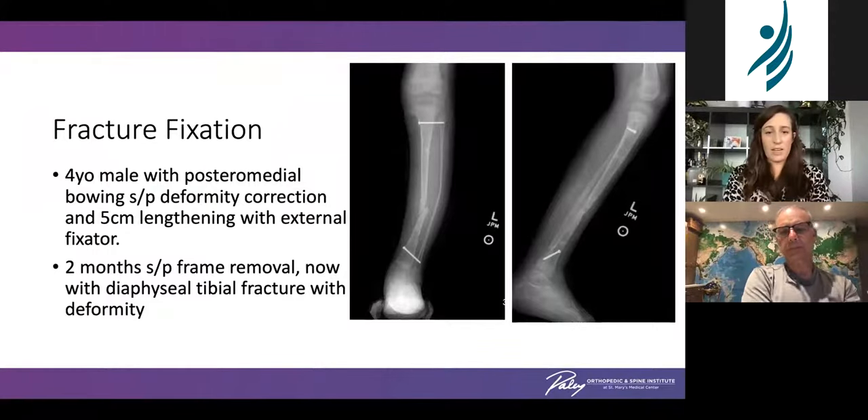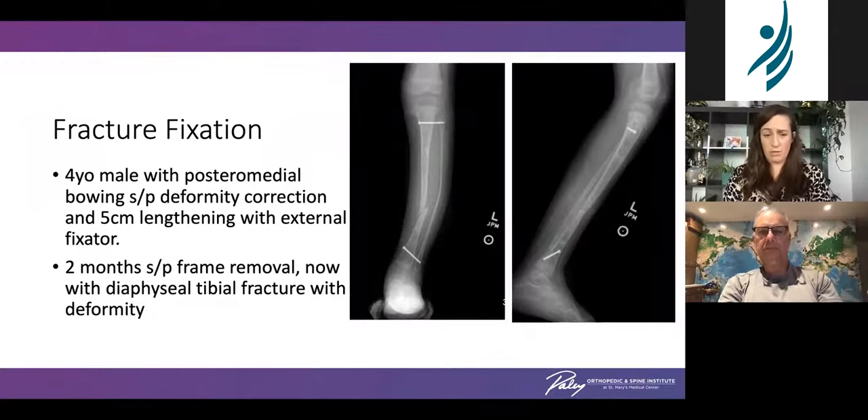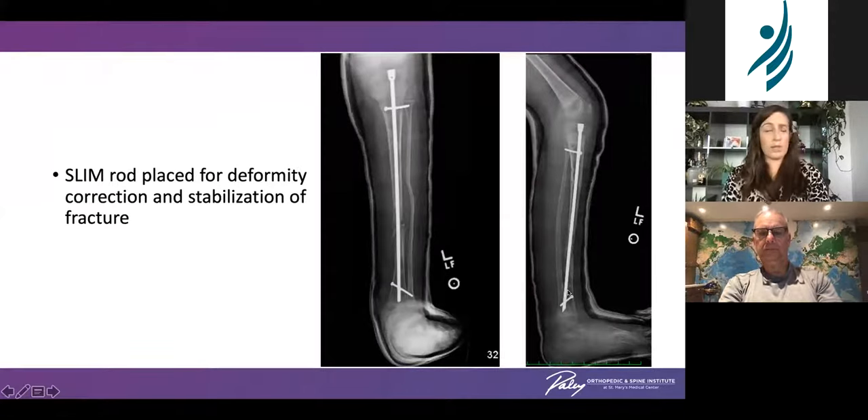Fracture fixation — like we said, we don't see typical pediatric fractures but we do see them. This four-year-old boy had been treated for a posterior medial bow, had an external fixator for deformity correction and five-centimeter lengthening. His frame was removed two months prior to him showing up with a diaphyseal tibial fracture in the area of the regenerate, and unfortunately he developed some varus deformity. This was taken to the operating room and — these are fresh off the presses — we were able to correct the deformity and nicely stabilize the bone with a slim rod. He is now much happier and more comfortable and will go on to heal quite nicely.